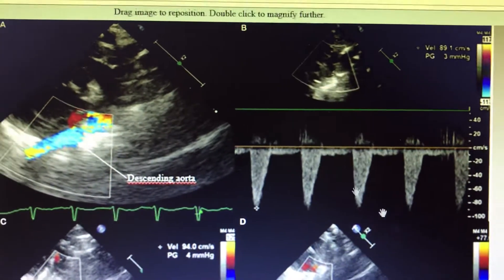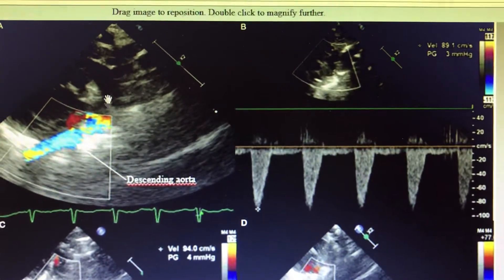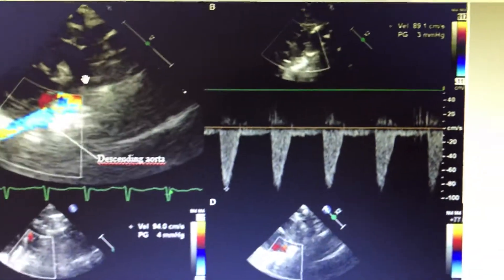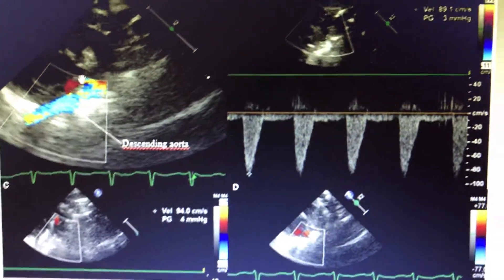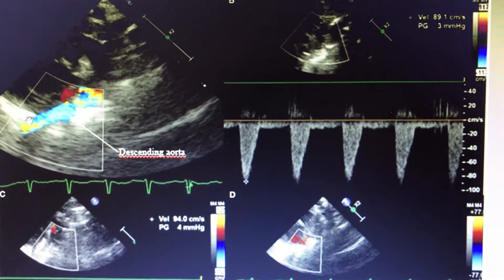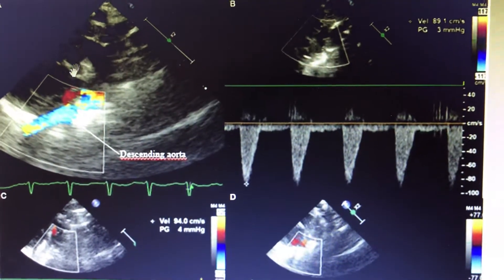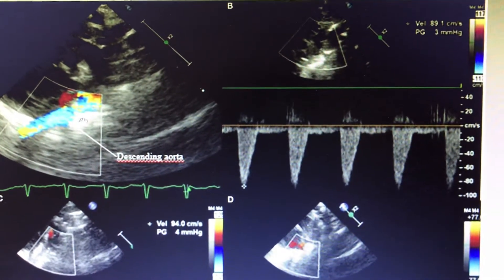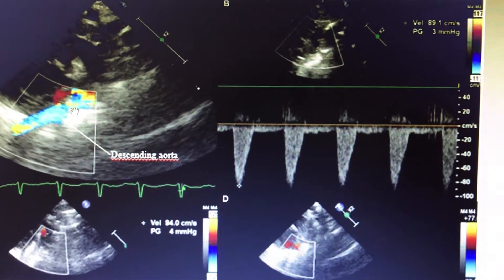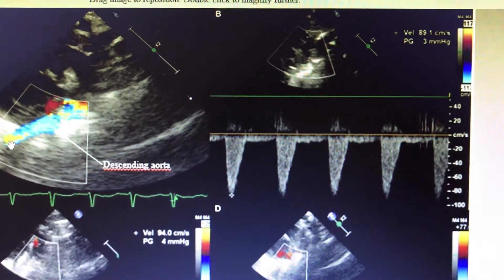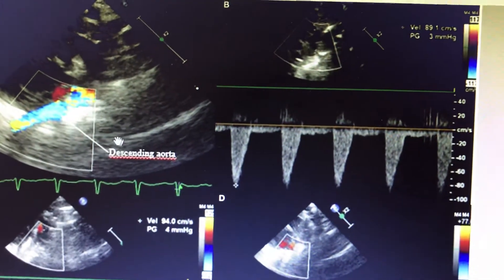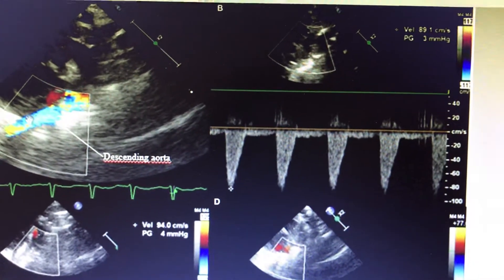Yes, this is what we were discussing. This is the supra-sternal view of the aorta, and you have taken the cursor on the PDA and the descending aorta. So predominantly we are focusing on the descending aorta at the junction of the PDA, and then you can proceed for whatever length of the descending aorta you can get.